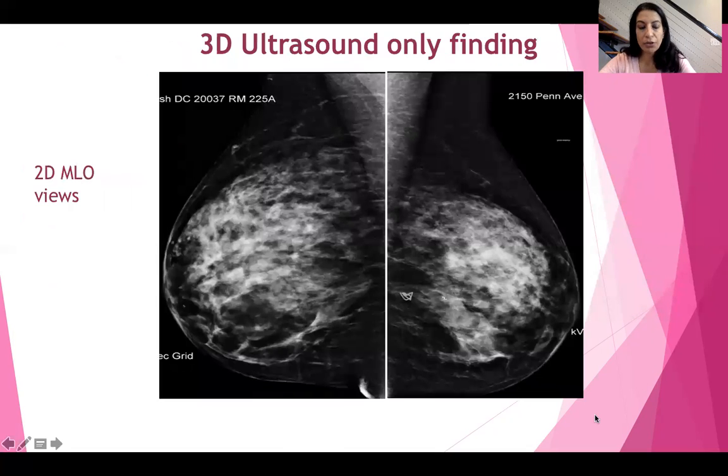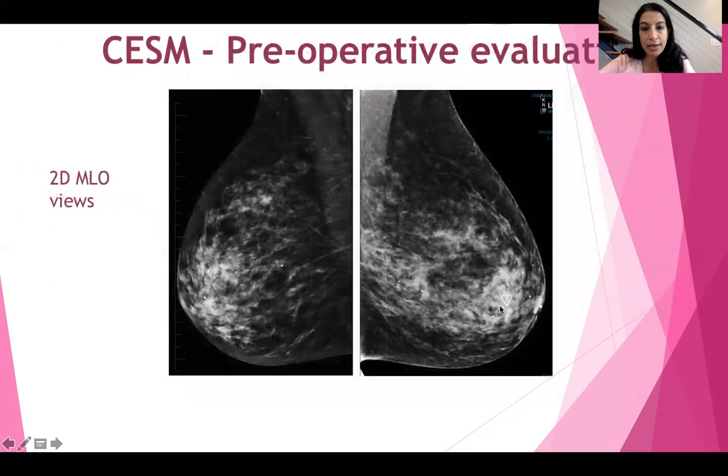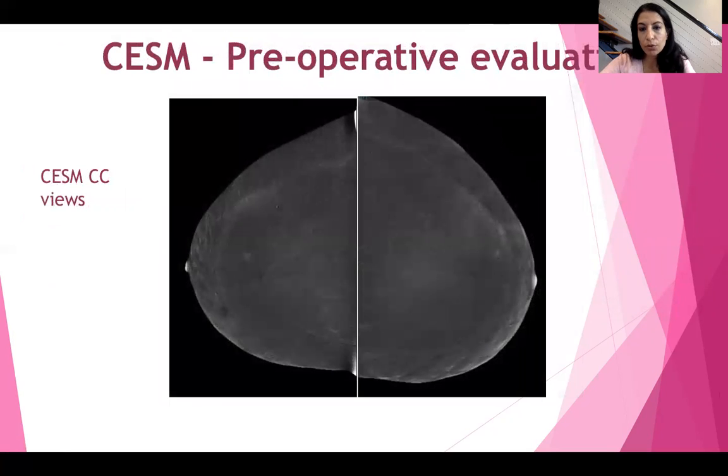This is the MLO view of the breast. And on CESM, after her region of palpable concern was diagnosed to be a breast cancer, she came in for a CESM. So you see here was the area that she was feeling. It was diagnosed to be a breast cancer, and that's what it looks like. And you'd almost think this is a mirror image because she has a matching area of increased activity in the opposite breast. And that went on to be a cancer as well. So she had almost matching cancers in both breasts.